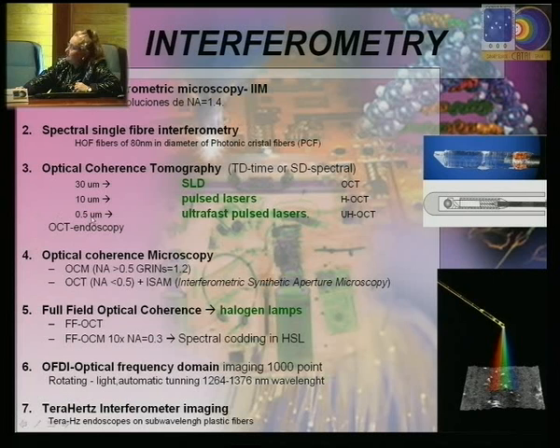So it's a very good resolution that allows you to obtain almost microscopic images from the things you are viewing. But interesting enough is the fact that even using halogen lamps in a macroscopic view, optical coherence tomography can have a very good resolution.